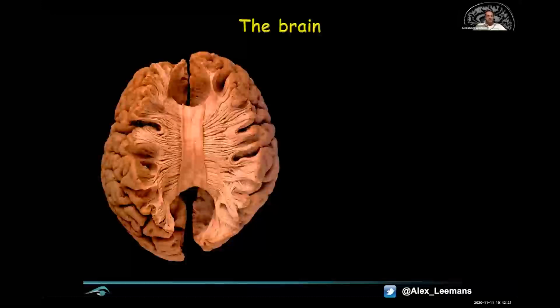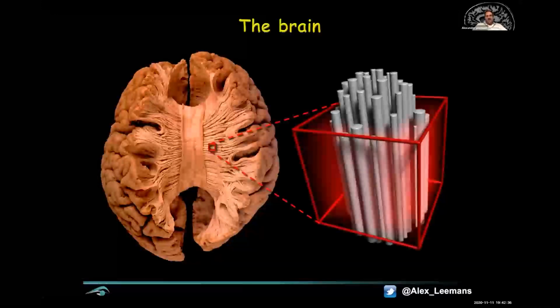If you look at this image, this Klingler dissection, you can appreciate this fibrous structure. The first thing you can think of is spaghetti. It seems like the white matter of the brain acts like big spaghetti bundles connecting the different brain regions. And you can literally think of this as axonal fiber pathways, these cylindrical objects, with myelin sheaths wrapping around the axons.